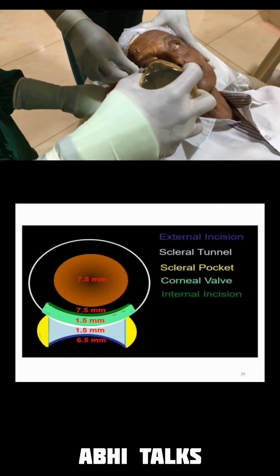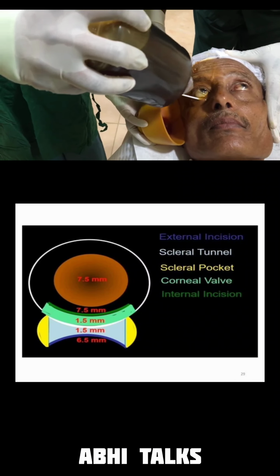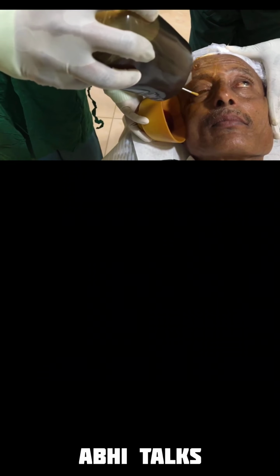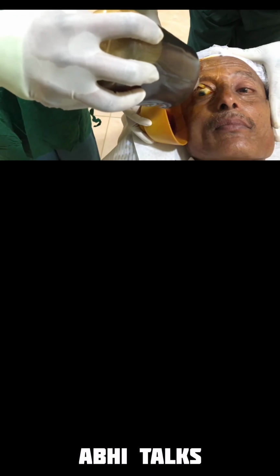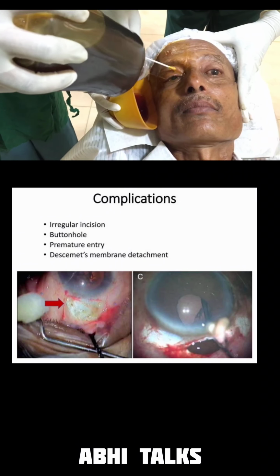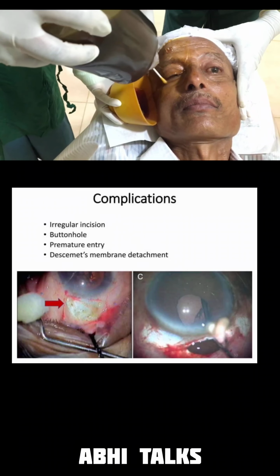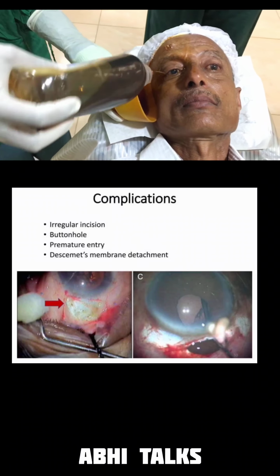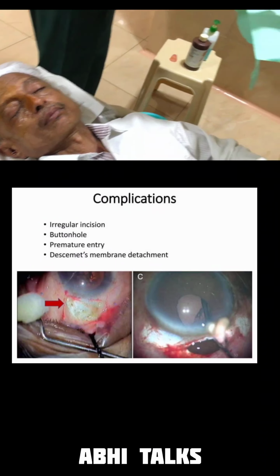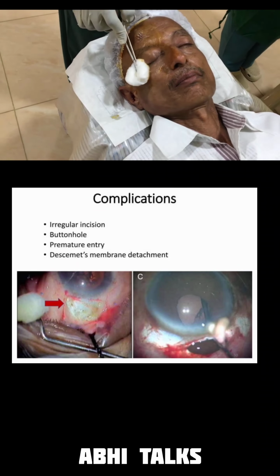An assistant will pour the solution, Ringer lactate solution containing 0.5% of betadine, into the medial canthal area, the lower lid, lower fornix, and he'll move the upper lid up and down in the natural eye movement position, so that any floating particles, oils, drops, tears, meibomian secretion will come out. There's no pressure applied on the face. It's gentle, natural movements. The eye has been anesthetized before doing this, so patients won't have any sensation. At the end of it, he'll take a dry cotton swab and clean it up. Only once. He's not going to repeat that.